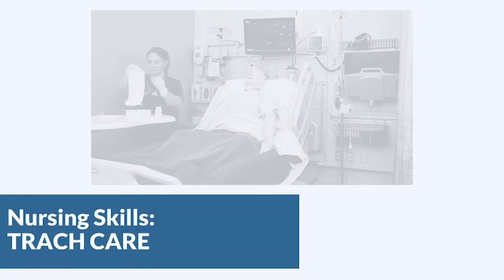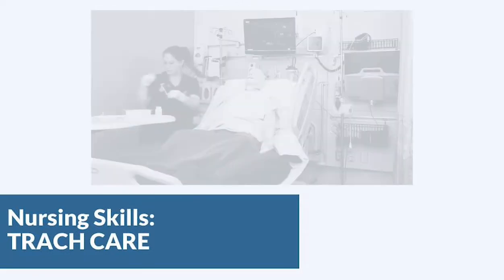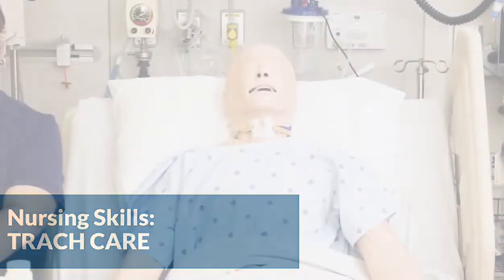Remember, as you're doing this, you want to be assessing the stoma for signs of infection or skin breakdown while you look at it. The other thing to remember is that if the patient coughs, you could be exposed. So we always recommend goggles or a face shield during trach care.